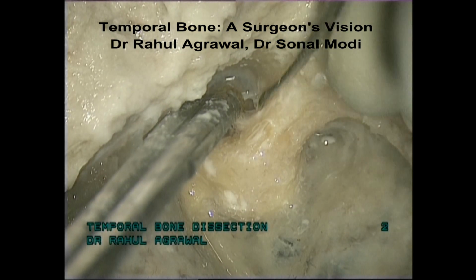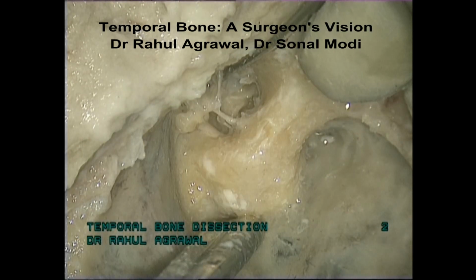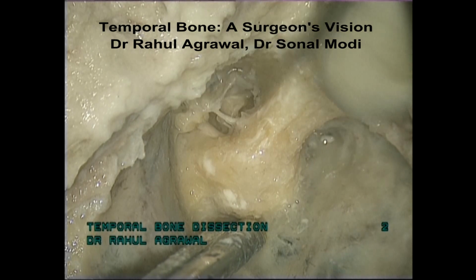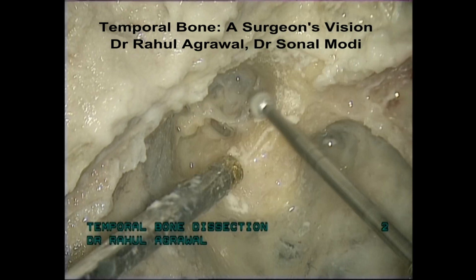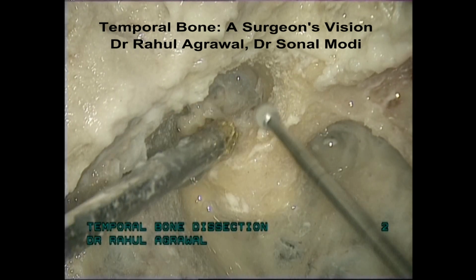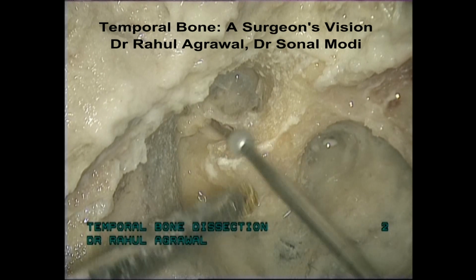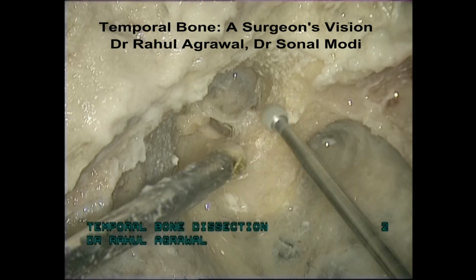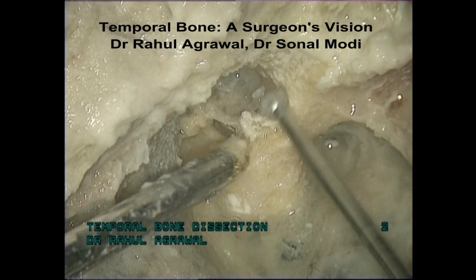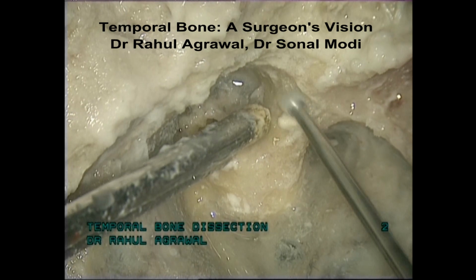Now elevate the tympanic membrane in the posterior segment. In live surgery, this step will depend upon the extent of cholesteatoma. If the cholesteatoma is going into the sinus tympani, lower the facial ridge, drill along the length of the vertical segment of the fallopian canal. Your drilling should always be parallel to the facial nerve.